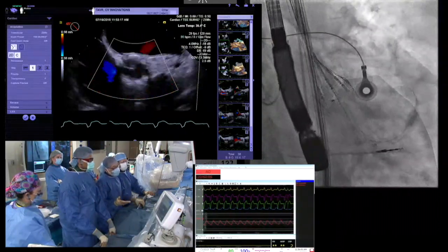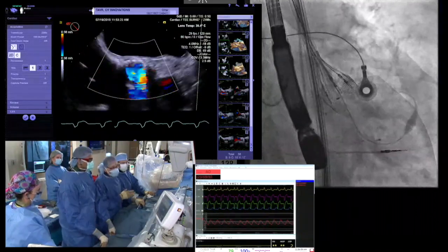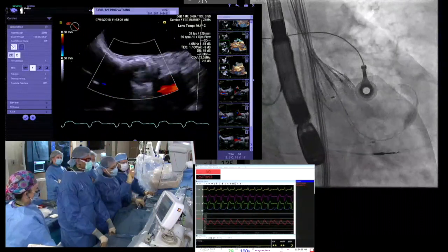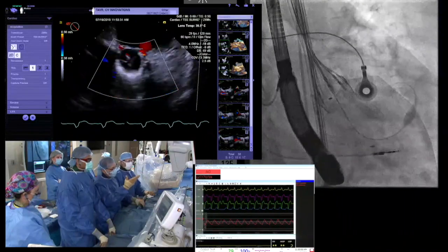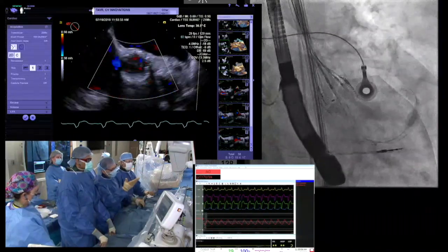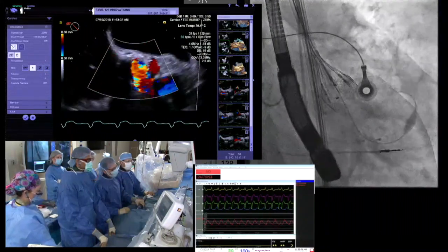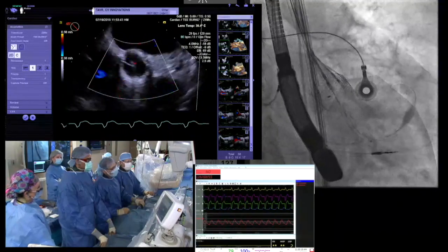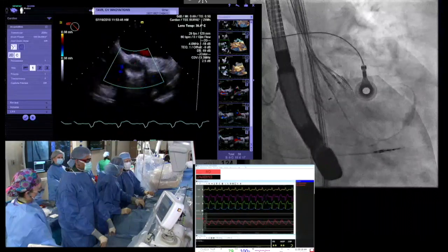The one thing I want to stress is we're having a fairly easy conversation here, just back and forth to refine our position. And given that time, I'm not doing anything. You see we've locked on 2 of the 3. Do you see that, Bill? Yeah. We've got a little bit of a barrel shape to this. There's not tons of calcium to grasp on this. So I think what we're going to want to do is a pretty aggressive push-pull tug test. What do you think? I think so.